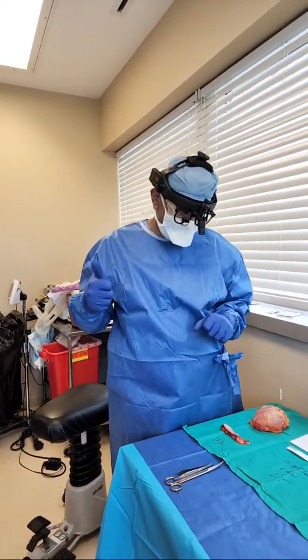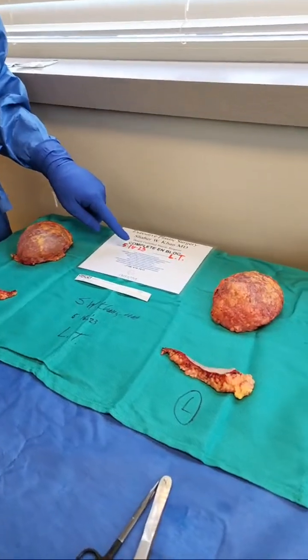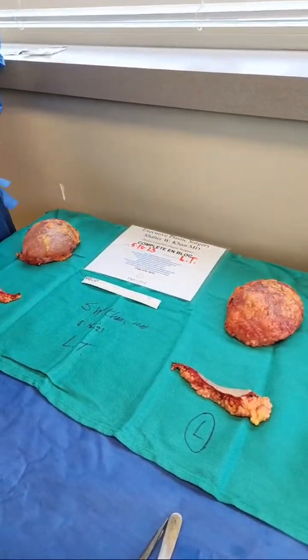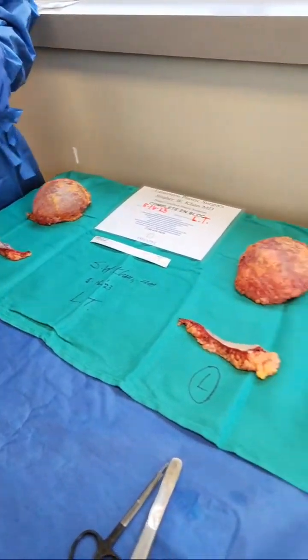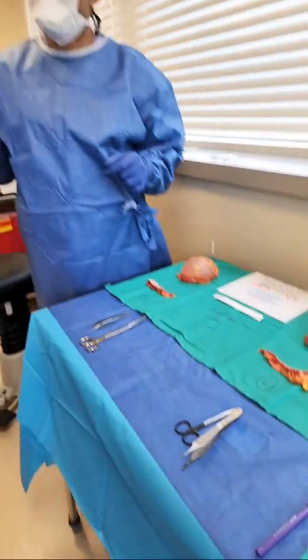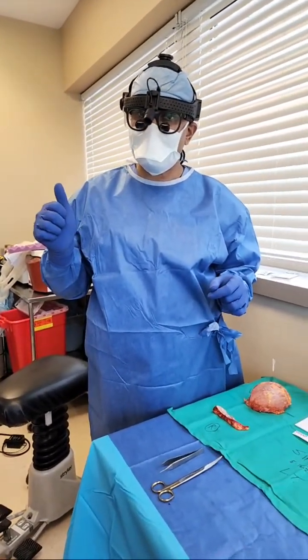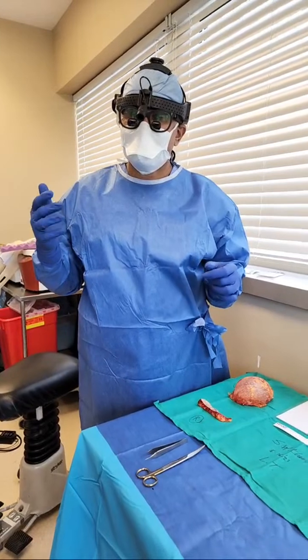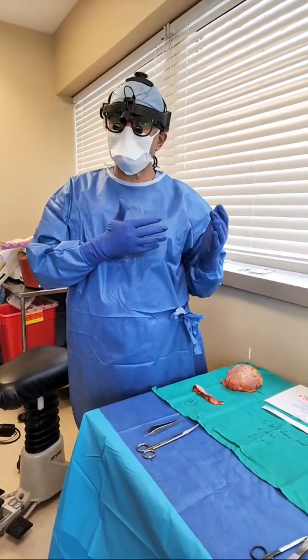Done an en bloc on a patient who is only 24, 5/16/23 en bloc, initials LT. Now what's interesting is she had a surgery done in 2019, just 4 years ago, and she had a grade 4 contracture on the right and also a grade 4 contracture on the left.